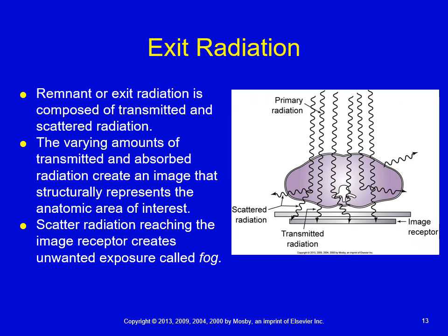Some of the X-rays will be absorbed, some of them will scatter, and also some of them will be transmitted to help create the image that we need for the patient's diagnosis. So really, you need to know what remnant or exit radiation is.